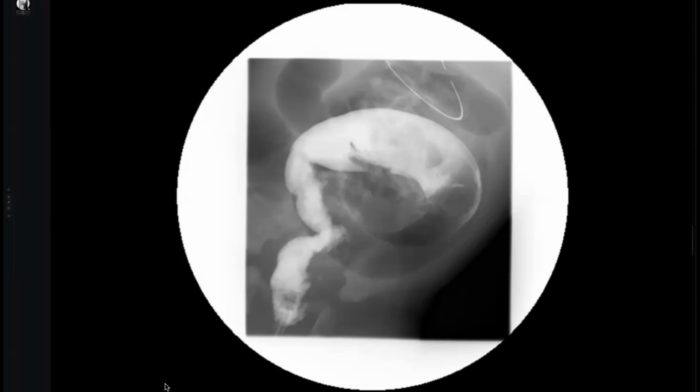Aganglionic. Aganglionic? Aganglionic. Yeah. So what is the name of this segment? Aganglionic segment. Okay. Yes. What else? I saw aganglionic segment and irritation. That's all what I know.